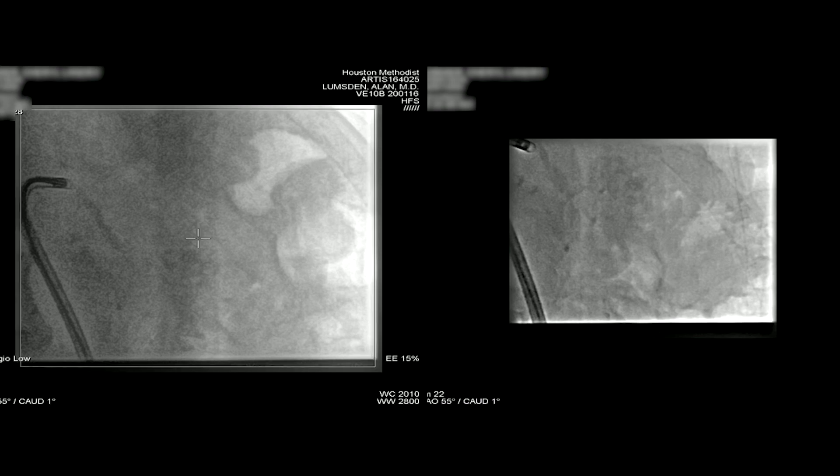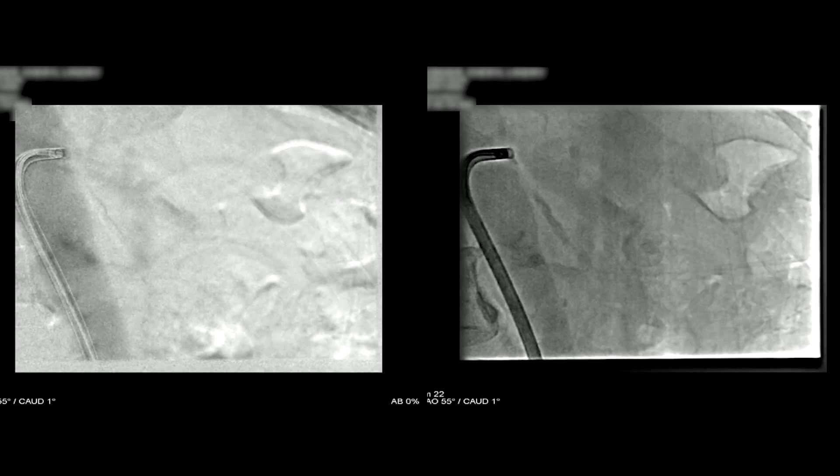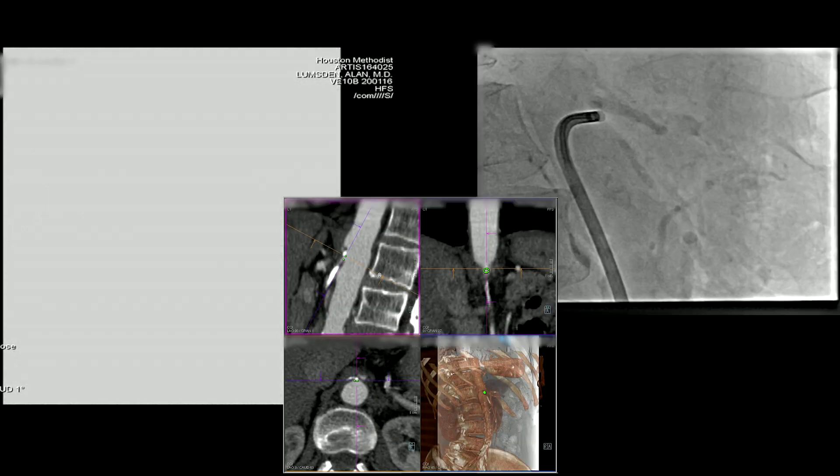This is just an example of how everything keeps deflecting off the anterior wall — we never really could engage it. We really should have done this completely right at the beginning of the case.